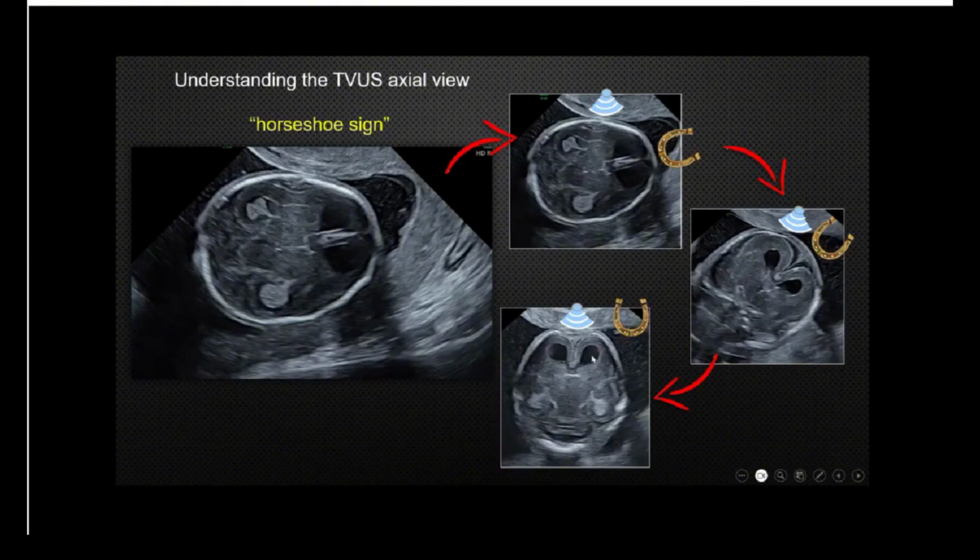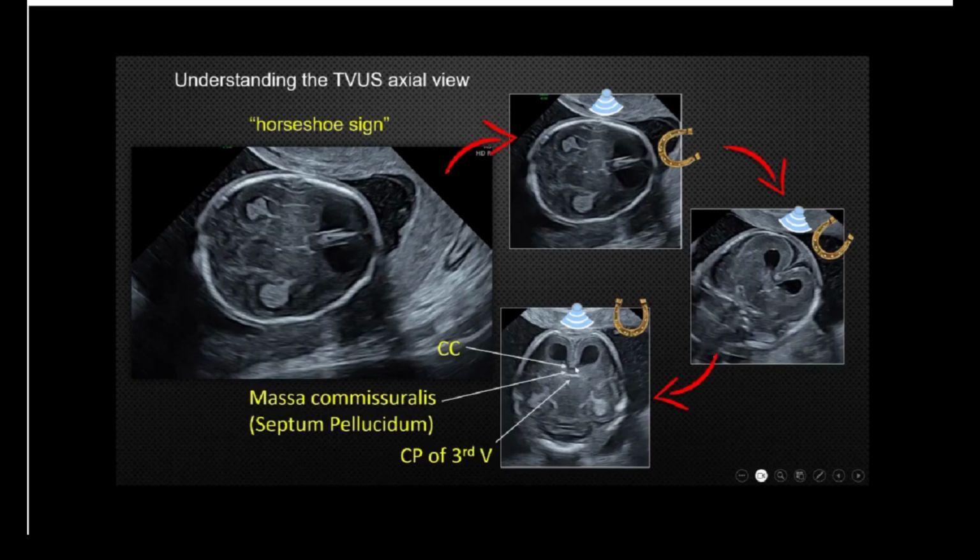the filters that gives you a high contrast image, and then you can come up with these three echogenic layers: the corpus callosum, hypoechoic, the third ventricle roof, the tela choroidea crosses through the Monro, which is hyperechoic, and in between them, these are the massa commissuralis cells, which did not give rise to the cavum septum at this stage. So please don't call this a cavum septi pellucidi.